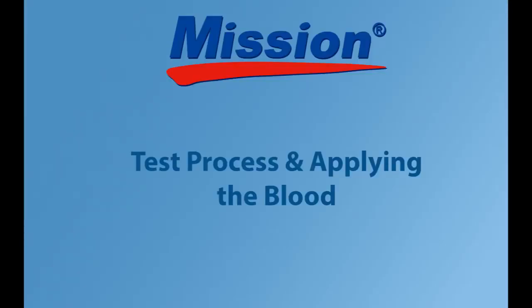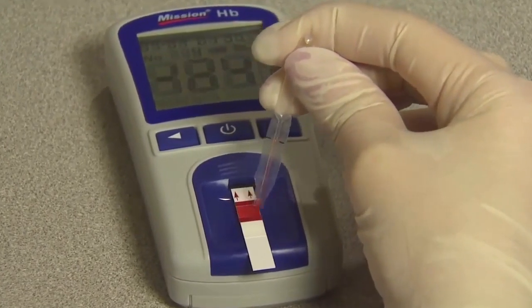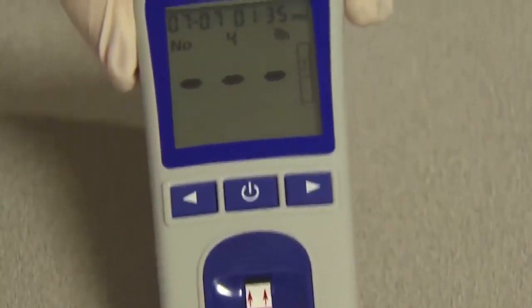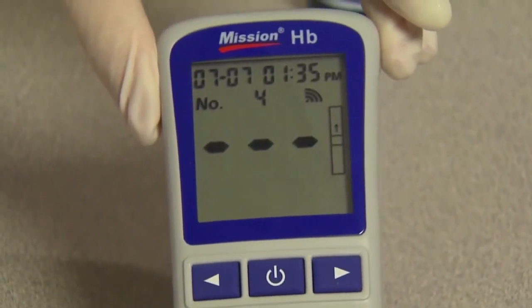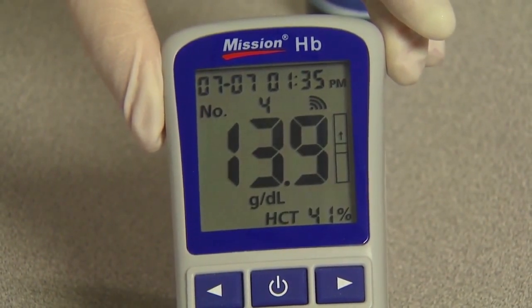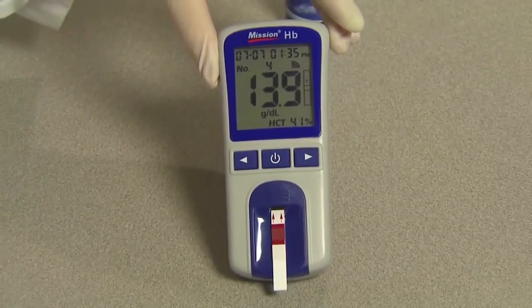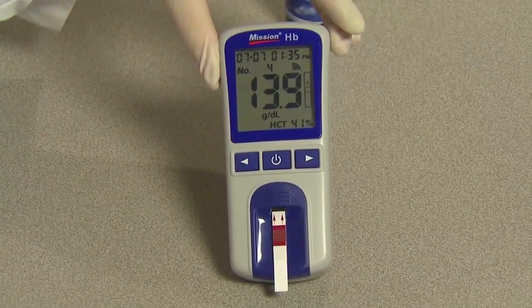Test processing and applying the blood. Apply the blood sample to the center region of the specimen application area of the test strip. The meter will begin testing automatically with three dashes in a line flashing on the display, indicating the test is in progress. Results will be displayed in about 15 seconds with HCT value displayed at the bottom of the screen.